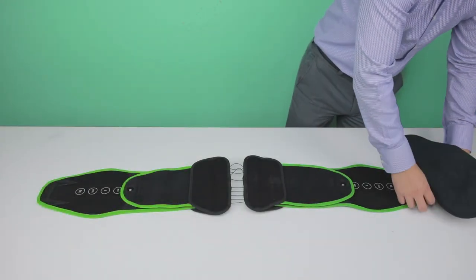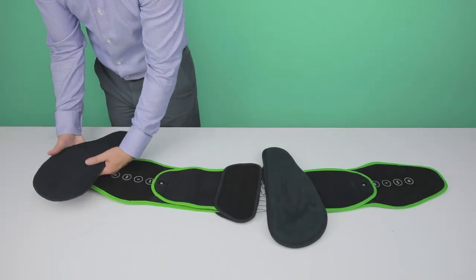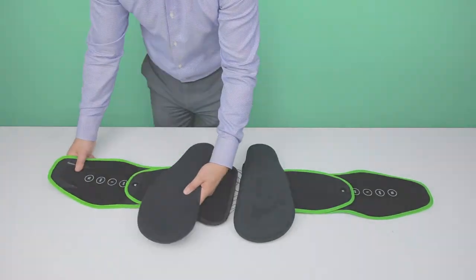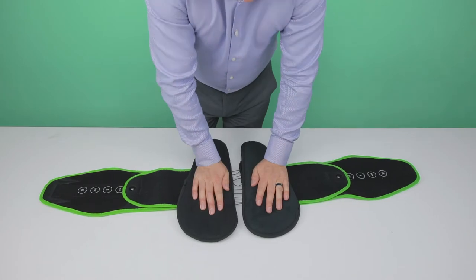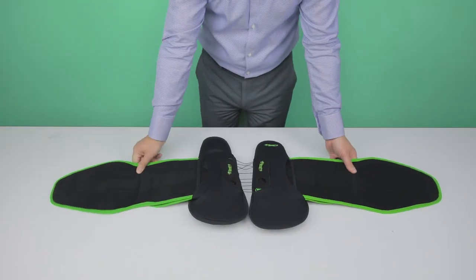Slide both independent posterior panels over the center clamp and press down firmly. Turn over and place the pull handles back to the starting point.